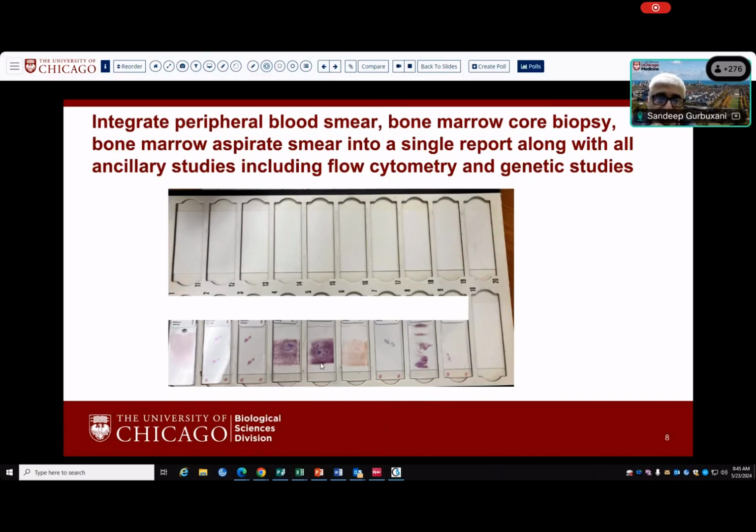So you have these spicules on this slide here, and whatever's left at the end of the procedure is then put in a mesh bag. It's fixed in formalin. The advantage here is that when you have cells here, this is never going to be decalcified, and it provides really good material for any molecular studies that you might have to do on archived material 6 months, 8 months, 10 months, or even several years after the procedure has been done for research purposes. So this is a good source of preserved nucleic acids here.